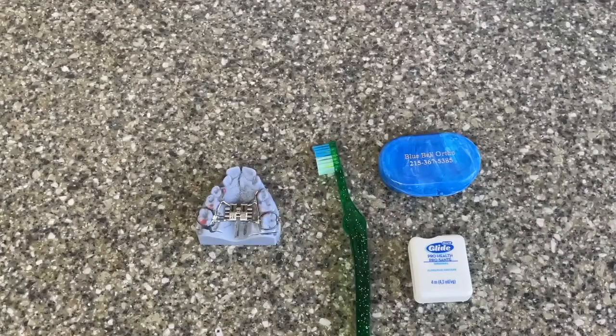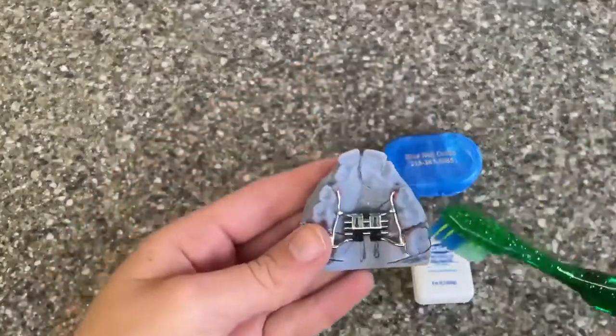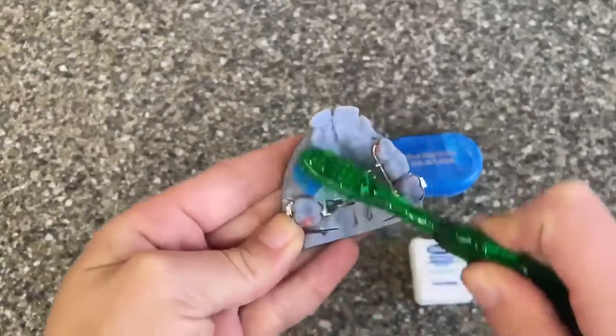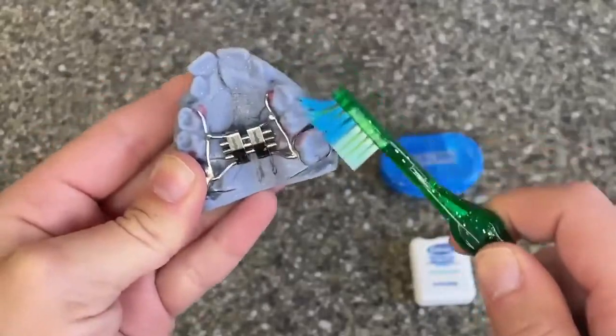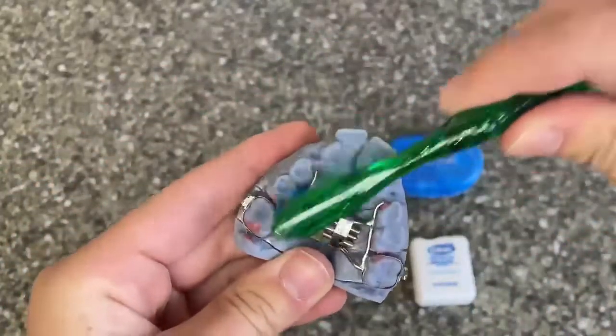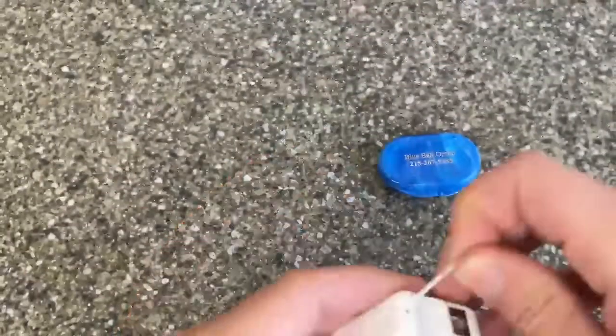Now that you have your expander, let's go over some basic care instructions. When brushing your teeth, it's going to be a little bit different. You're going to want to brush every area that you see metal. We recommend doing this because food gets lodged into those small crevices. Rinse really well with water or mouthwash, especially if you ever feel like any food is stuck at the roof of your mouth.